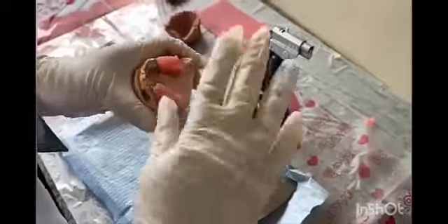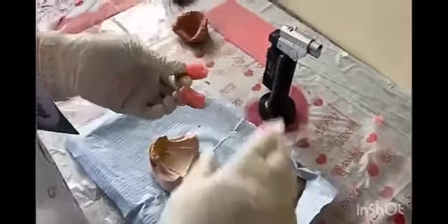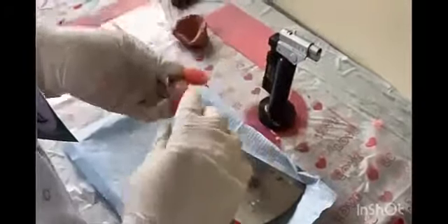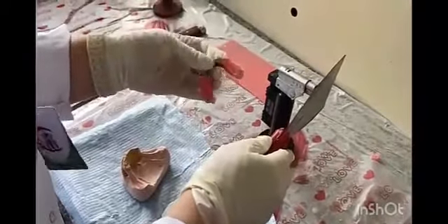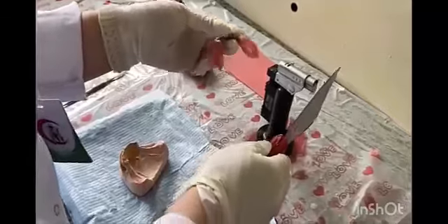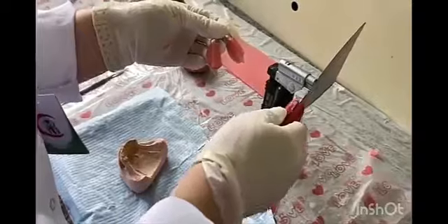أوّن ما أعمل confirm إن الmetal seated completely في مكانه، هبدأ أضبط الoutline بتاع الwax rim. الocclusal plane أو الheight بتاع الwax rim لازم يكون في نفس الlevel بتاع الnatural adjacent teeth. أنا هنا حاسس إنه عالي شوية، فهعمل softening وهشيل شوية من الheight بتاع الwax rim.